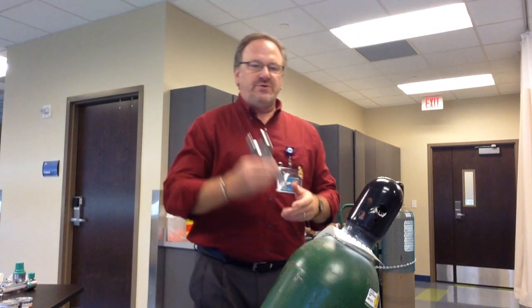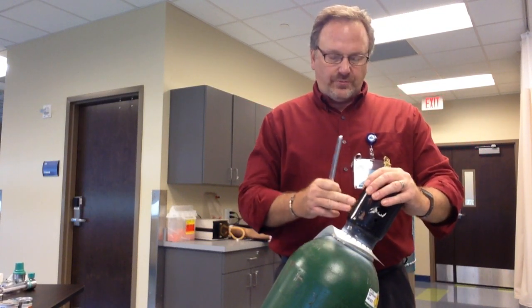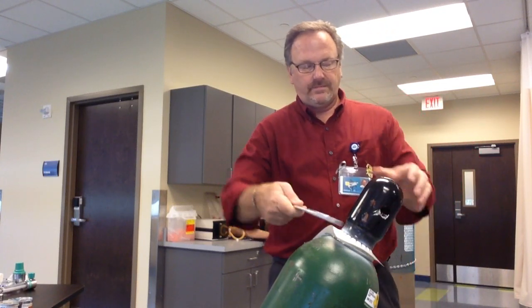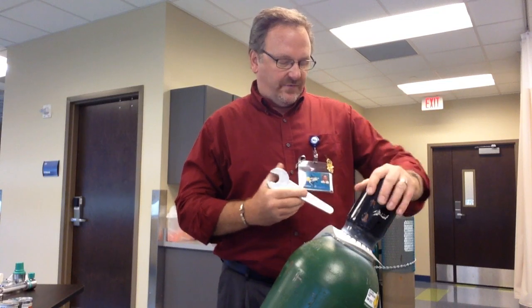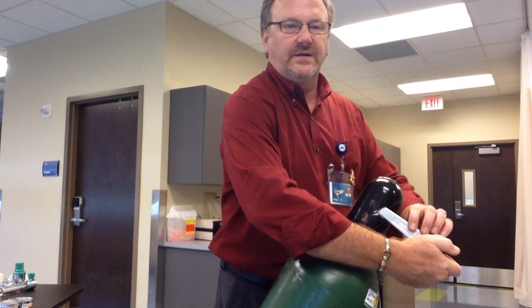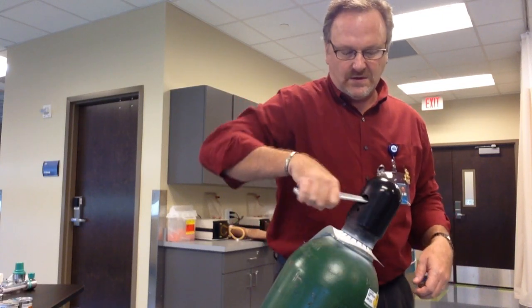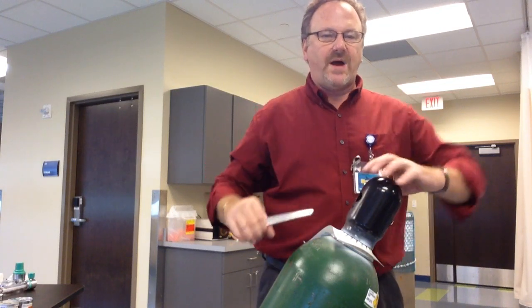I take one of my gauges — I'm going to use my oxygen gauge. This is a safety cap to protect the valve that's in here. If you go to take it off and it's all rust and you can't get it off, use light taps — all you're trying to do is break that rust loose. If you still can't get it, you can use this end — it is designed to go in, and you pop it and break it loose. Don't stick it all the way in because there is a valve in there, just a little bit and give it a quick pop. It should break it loose.